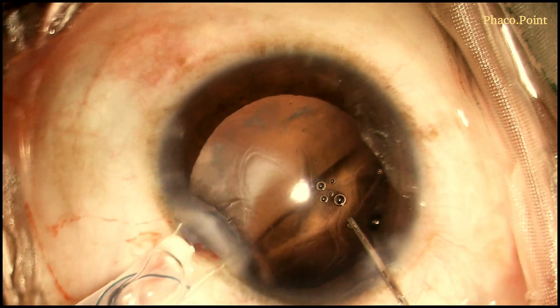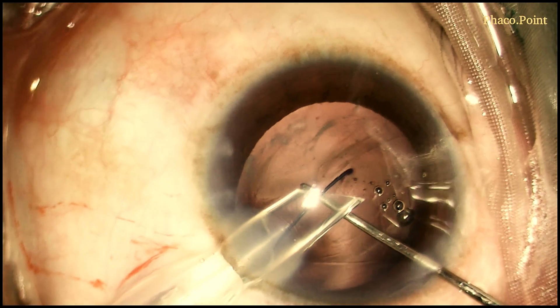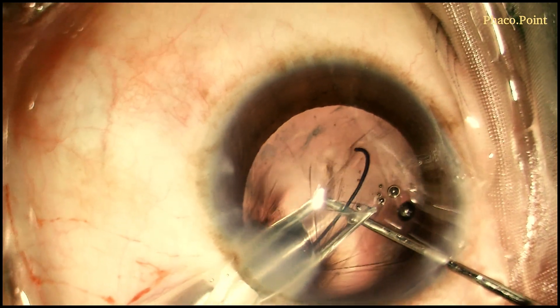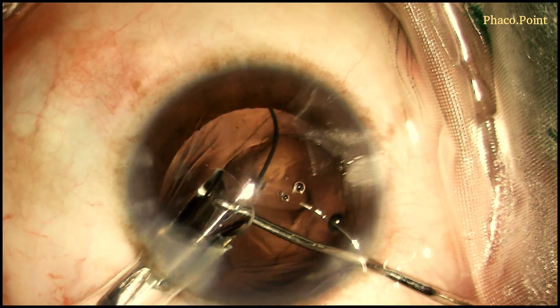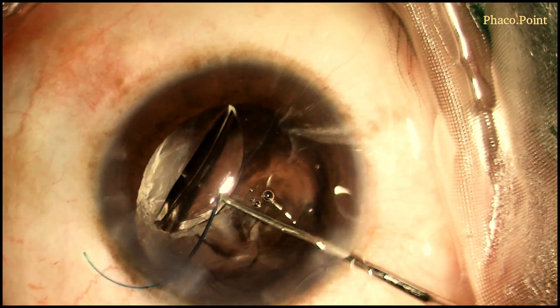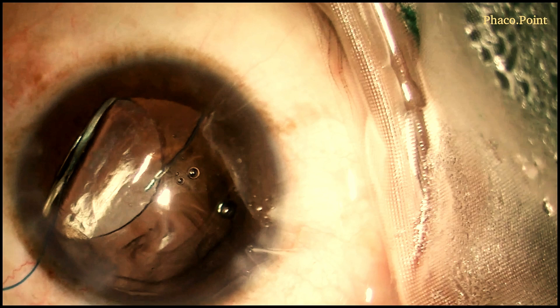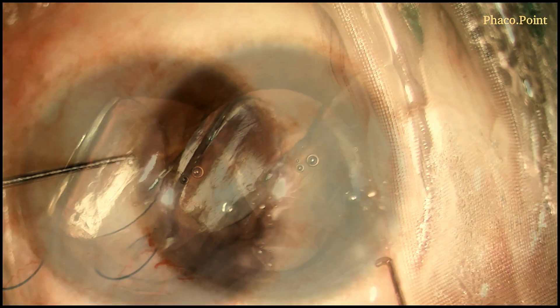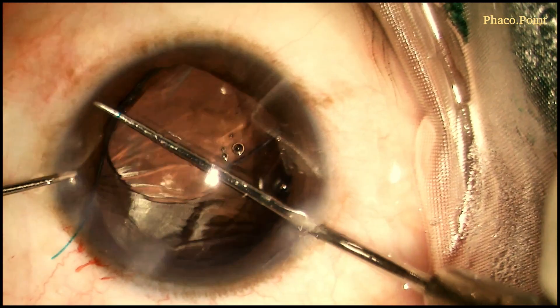Let's now move to the IOL insertion. Counter pressure is afforded with the Sinskey hook held in the paracentesis incision and the nozzle is introduced and rotated into the eye to achieve the correct optimal orientation of the leading haptic. Having achieved that, the haptic is now introduced with care and caution into the ciliary sulcus, after which the rest of the IOL is injected into the anterior chamber. Following this, the IOL is rotated so as to get the trailing haptic into the anterior chamber.